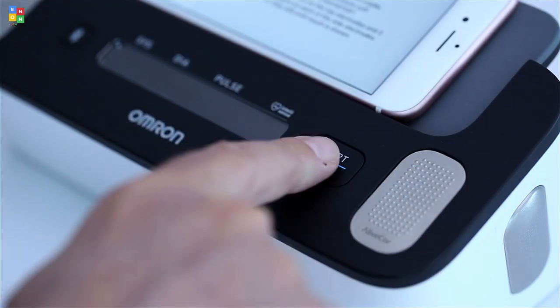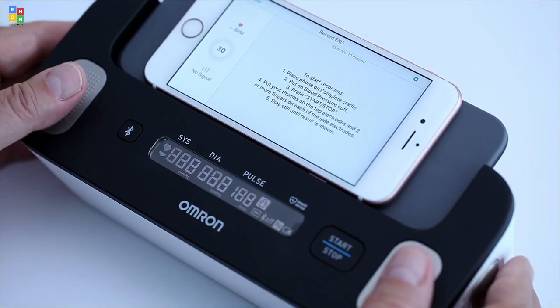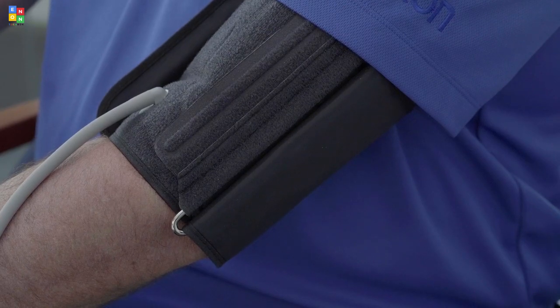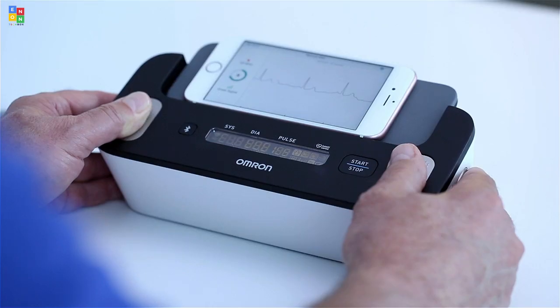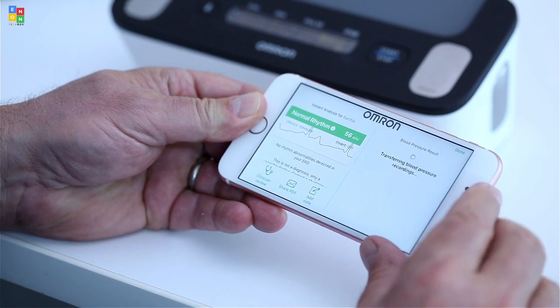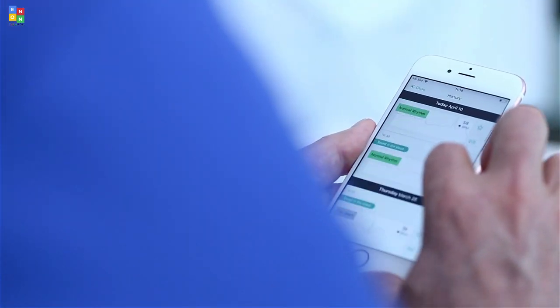Step 6. Press Start on the monitor to measure blood pressure and place your thumbs on the top electrodes and 2 or more fingers on the side electrodes. Remain still and do not talk until the arm cuff deflates and the 30-second countdown for EKG recording on your smartphone is complete. Step 7. Once the measurements are complete, your results are automatically transferred to the Omron Connect app for further review or to easily share with your doctor.